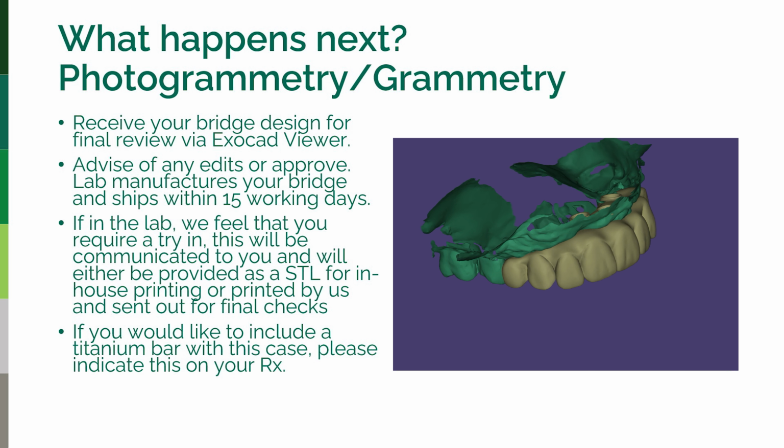You also need to let us know if you wanted perhaps to have a titanium bar within the restoration. If you're happy with a monolithic prosthesis, then that's fine. But it's a really good way of communicating with you what this design is going to be like.